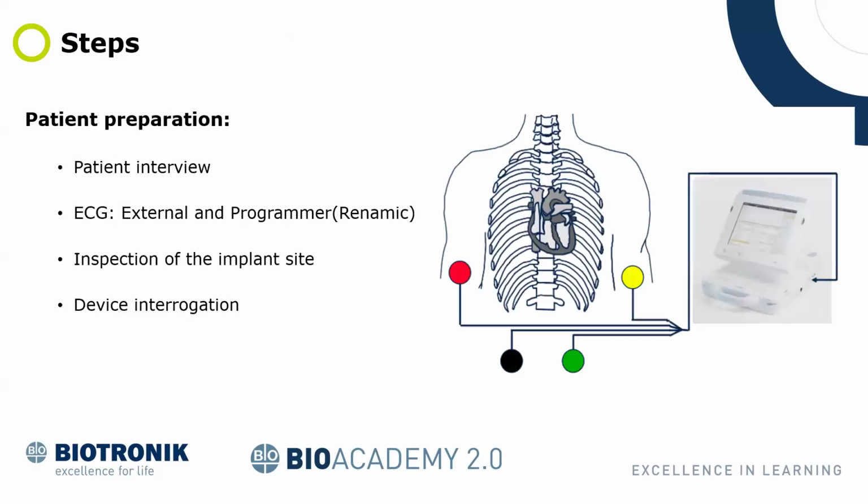For patient preparation, you do a patient interview and ECG, that is external and programmer, as shown here.